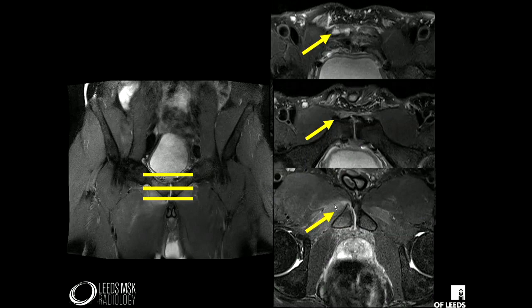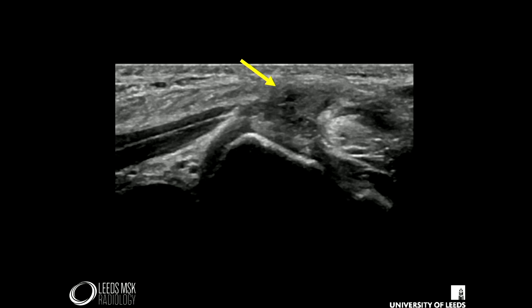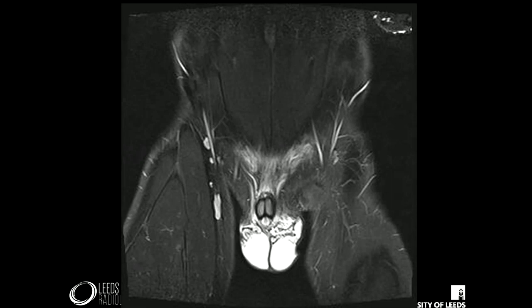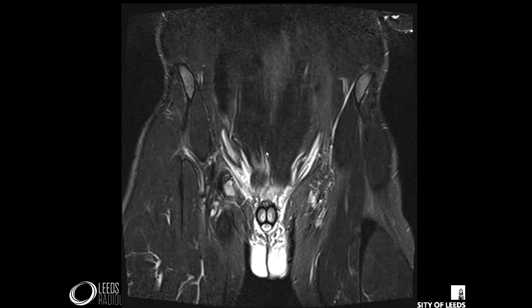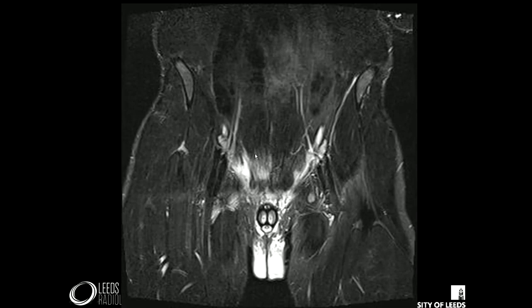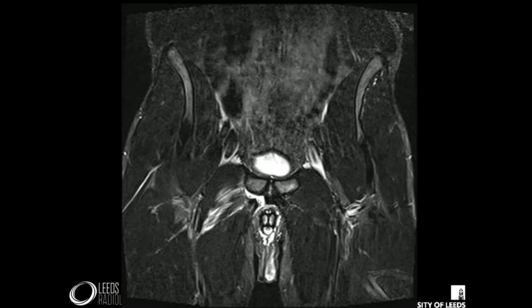Ultrasound can be very difficult. Here someone is symptomatic acutely and there's a small hematoma, but you can get thickening, and bony irregularity is quite commonly seen on ultrasound. In another player going through a coronal sequence, as we scroll through you can see hemorrhage within the inguinal canal, hemorrhage involving rectus abdominis and the right inguinal canal. As we come into the symphysis pubis itself, the two pubic bodies are relatively normal. There's a nice low signal capsular structure with intact left-sided adductor attachment merging together, whereas on the right there's an acute tear with hemorrhage into the adductor muscles.